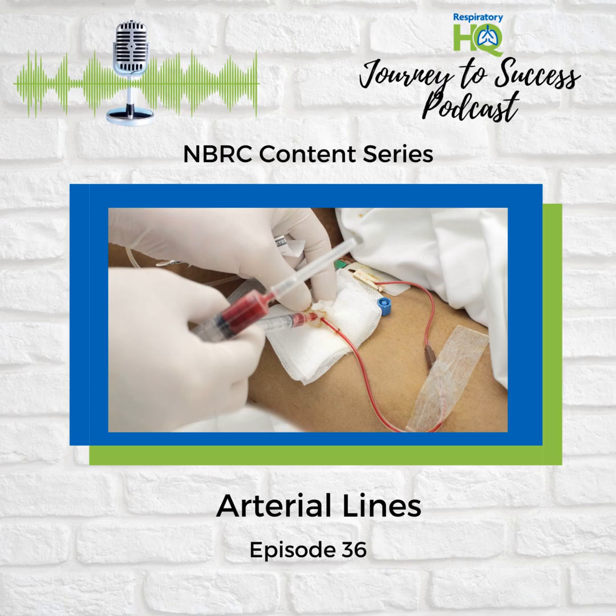Okay. So how do we actually measure all this pressure? I know the basics, like the inflatable cuff at the doctor's office and those wrist monitors you can get. Those are good for a quick check, but they have limitations. The traditional method, using a stethoscope and listening to the sounds as the cuff deflates, is called auscultation. That's the gold standard, but it takes practice. And then there's palpation, where they just feel the pulse to get a rough estimate, but those manual methods can't always detect diastolic pressure very well.